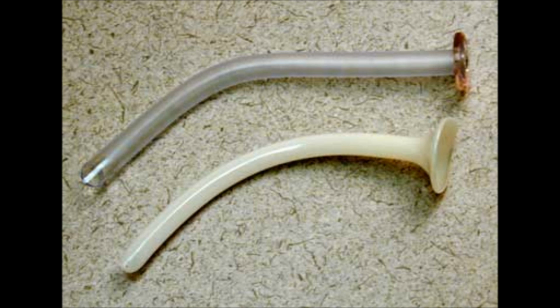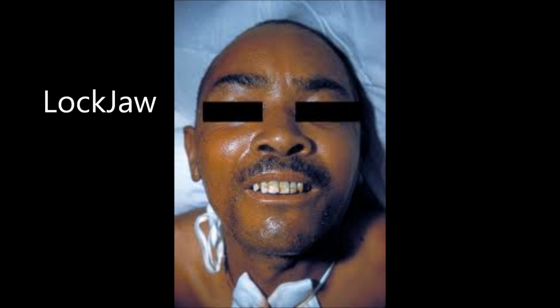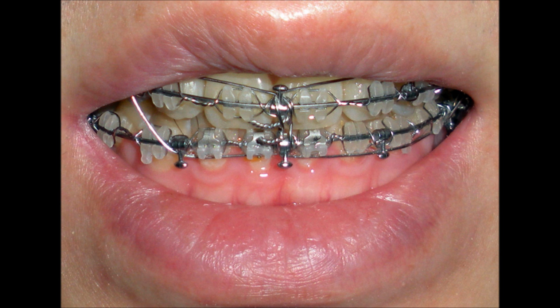As we all know, with an oropharyngeal airway, if your patient has an active gag reflex or is still coughing, then you cannot use an oropharyngeal airway and you substitute it with the nasopharyngeal airway. Other uses are when your patient not only has a gag reflex but also has trismus, massive trauma around the mouth, or wiring of the jaws.